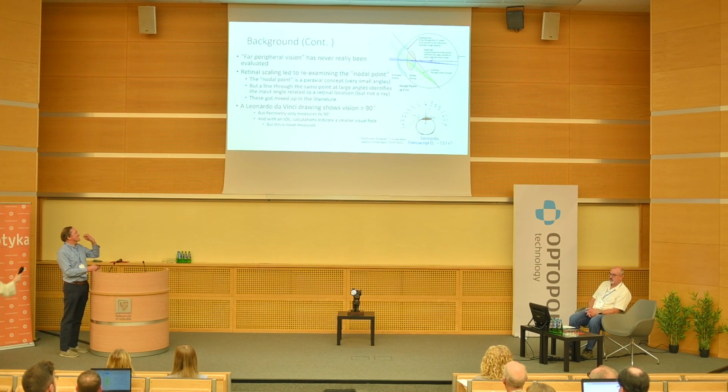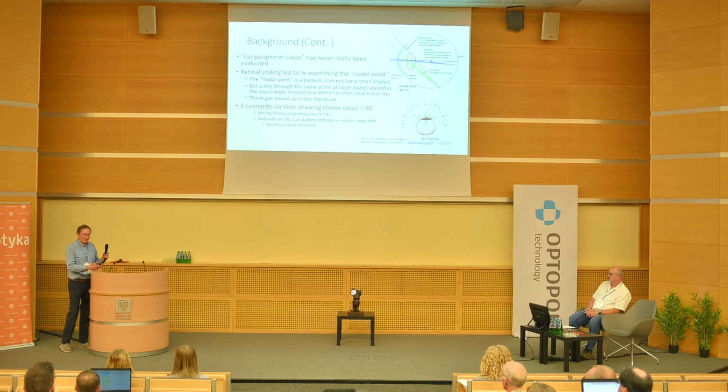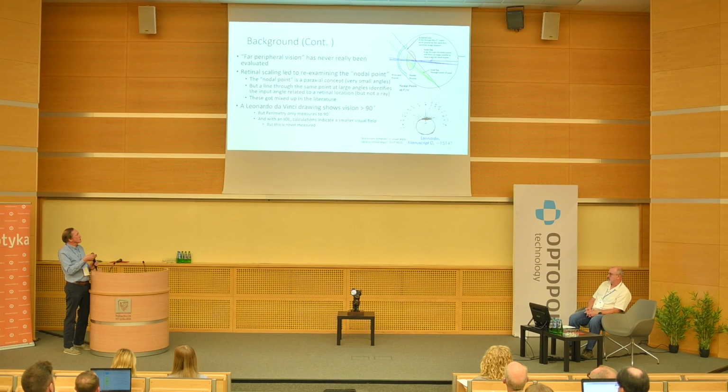So my summary of it is, if you have an optical system like this, you end up with both these properties. You get this paraxial property with another point at small angles, and it also gets this pointing thing at large angles. There was a German word that had direction ray. I'm not sure we have a proper phrase in English for it, because it never really came up.